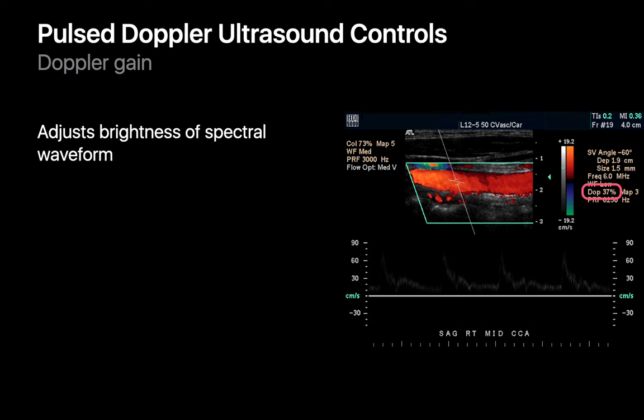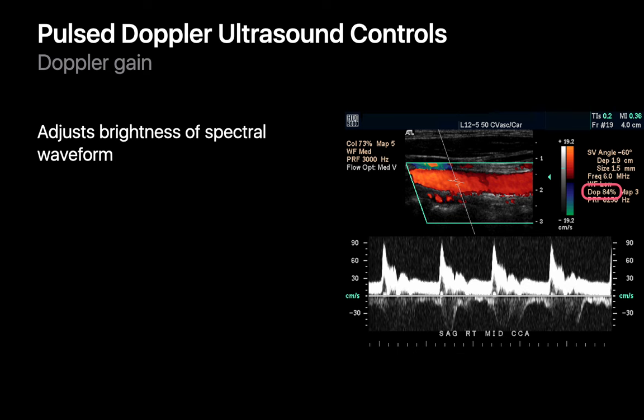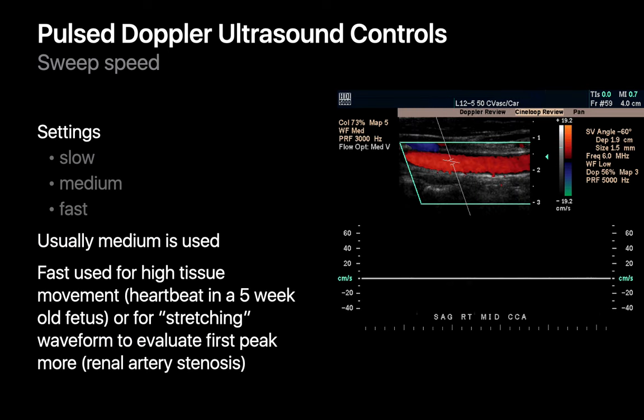Just like with your color Doppler box, you may need to adjust the gain of your pulsed wave Doppler waveform. If gain is set too low, it may be very tough to see a waveform, while a more appropriate higher Doppler gain setting makes the waveform nicely visible. Sweep speed is basically how many times per second we're plotting velocity using the Doppler waveform. We usually choose a medium sweep speed, but for situations where things are moving very fast — such as recording fetal heart rate — a fast sweep speed may be required.